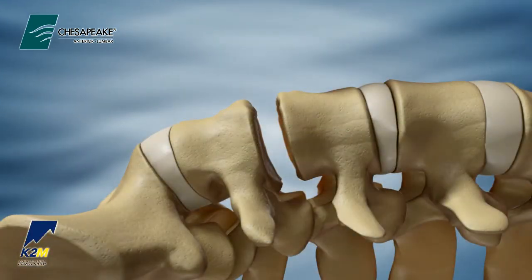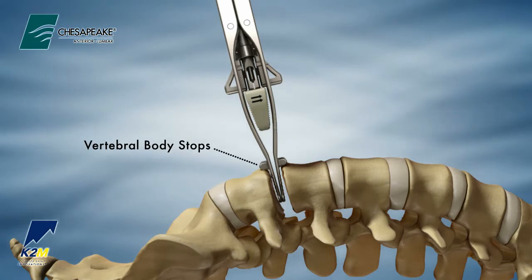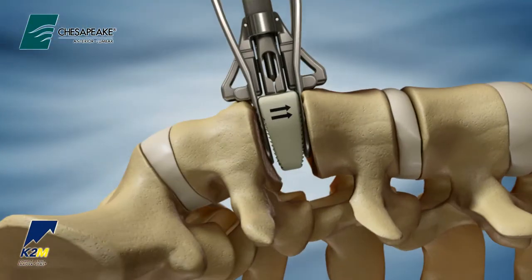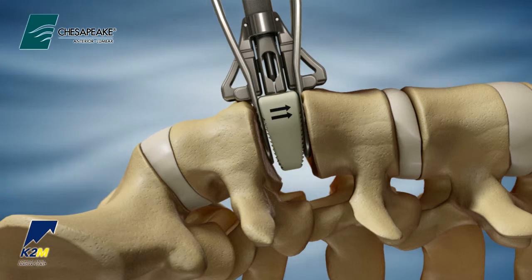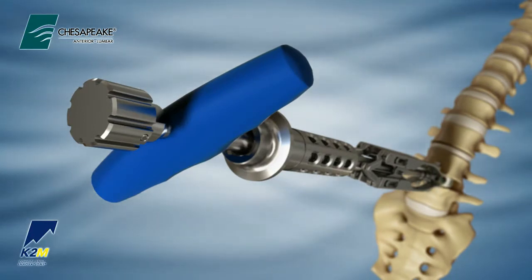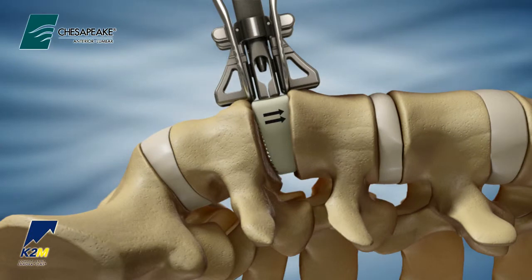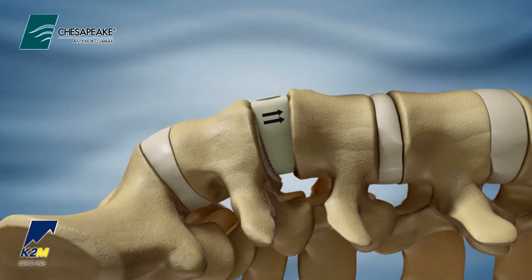Place the distal end of the distraction ramps into the disc space until the vertebral body stops make contact with the anterior portion of the vertebrae. Turn the T-handle clockwise to advance the implant into the disc space. When the countersink depth bar makes contact with the vertebral bodies, the anterior insertion ramp will begin to remove itself from the disc space while implanting the interbody according to the preset countersink depth. Turn the knob at the proximal end of the inner shaft counterclockwise to disengage the interbody. Remove the anterior insertion ramp from the surgical wound.